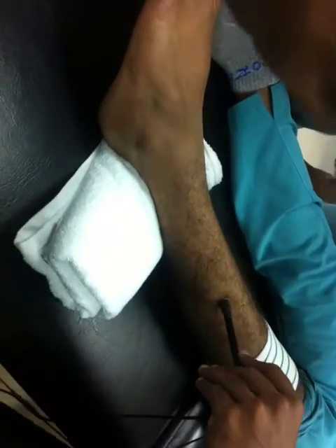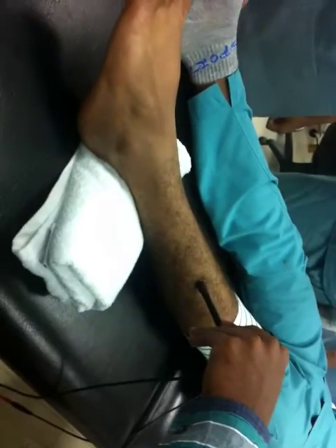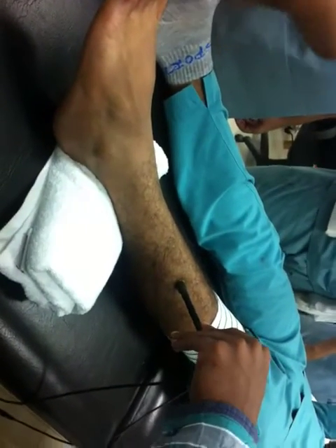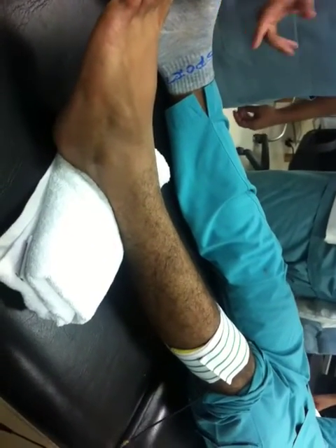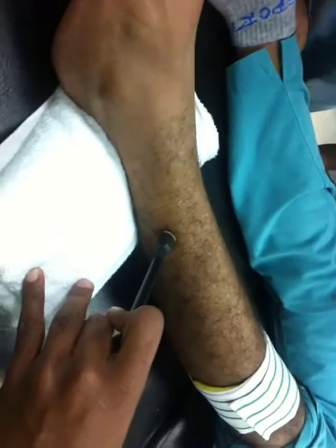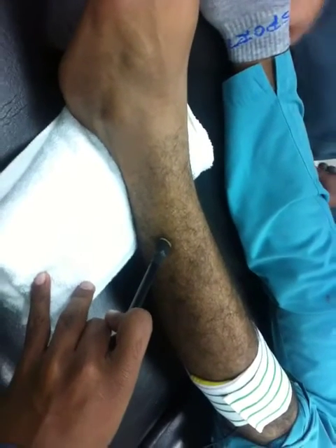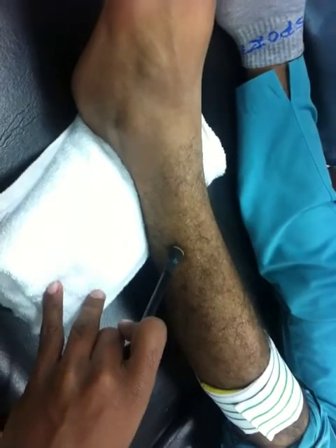We will forget about extensor digitorum longus. We will go with some other muscles — let's check. Maybe we will stimulate with someone else. Peroneus? Yes. Peroneus brevis. All peroneus muscles — peroneus longus and peroneus brevis. When I stimulate, are you getting the current?